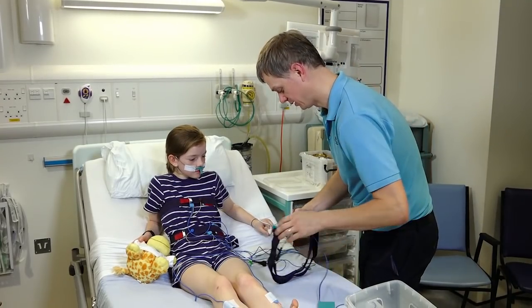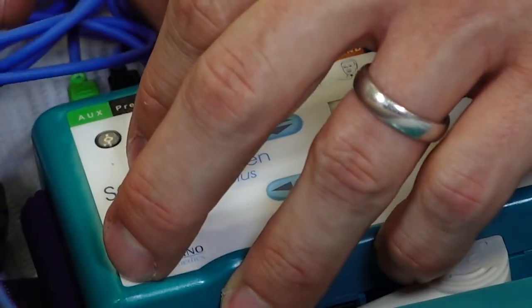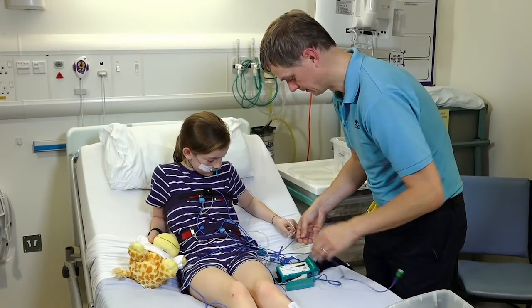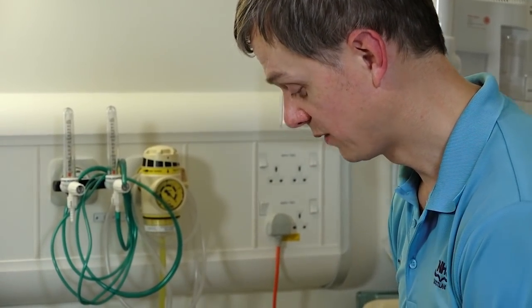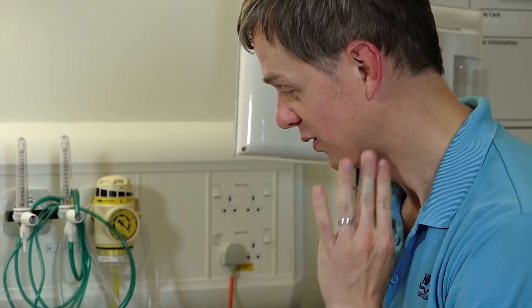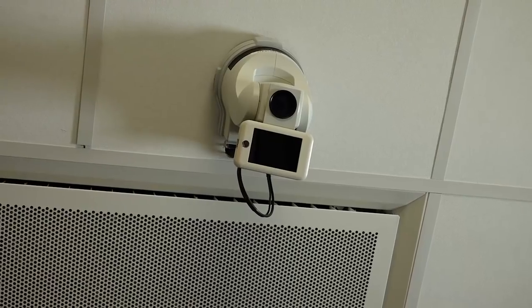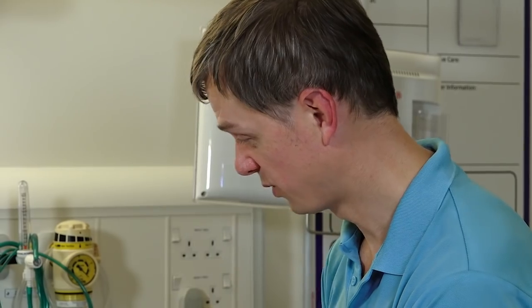Let me just plug these in and get you sorted. The sensor at your neck helps us pick up snoring by detecting vibrations. We also have a microphone and a camera — that camera at the side will help us work out what's going on too. Sometimes the noise or pitch of your breathing when you're sleeping can help us work out what's happening.